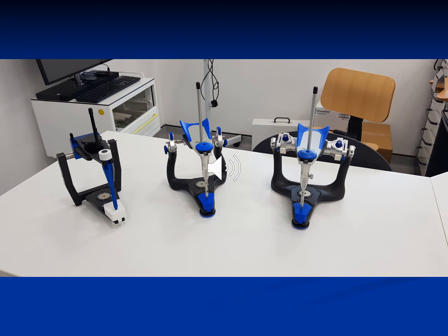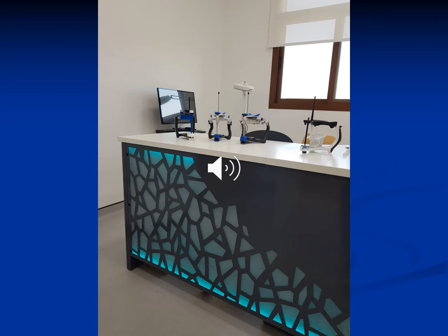Okay. Now there is another classification of articulators according to where the condyle is located. In the most right one, the condyle is located in the lower member, similar to what we see inside the patient's mouth. So it's more anatomical, and here we call it an arcon type articulator. While in the one in the middle, the condyle is located in the upper member and the condylar housing in the lower. This is called a non-arcon articulator type. And here I think on the most right you have the BioArt articulator, which is similar to the articulators that you are going to use in the laboratory to do your practice, inshallah.